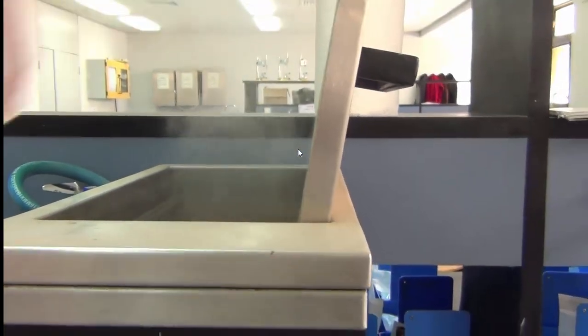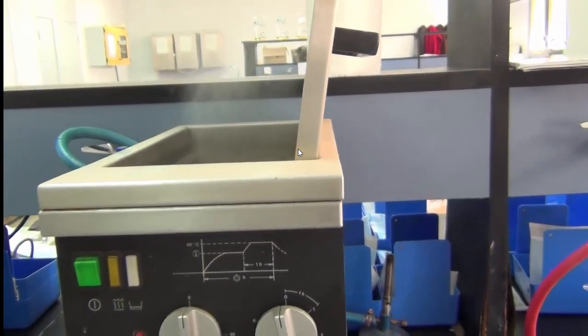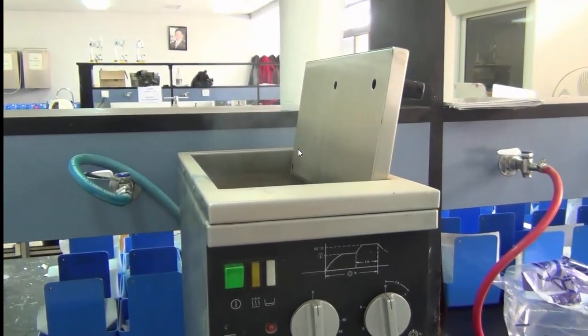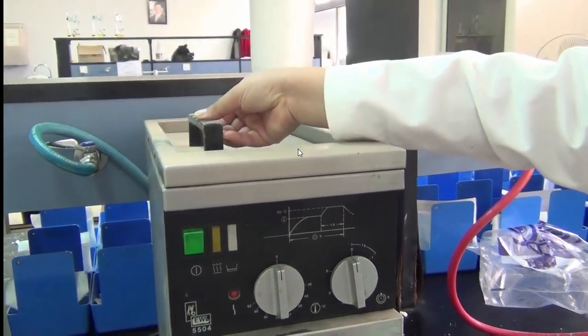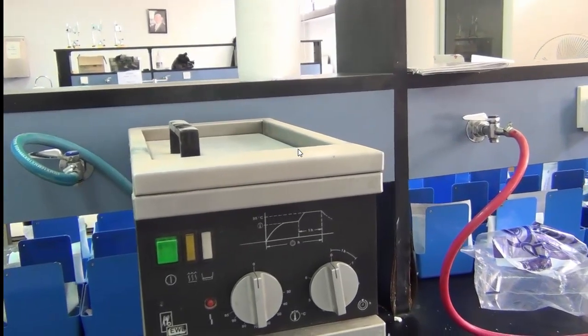Okay, and it's hot enough, and we'll place the clamp inside with the flasks inside this water. So we're using the manufacturer instructions. I'm not going to talk about numbers because you're going to follow the manufacturer instructions and you're going to know yourself, are you doing it in a long cycle or short cycle.